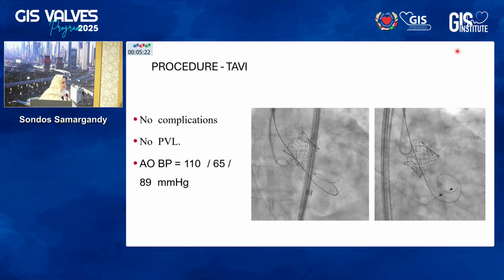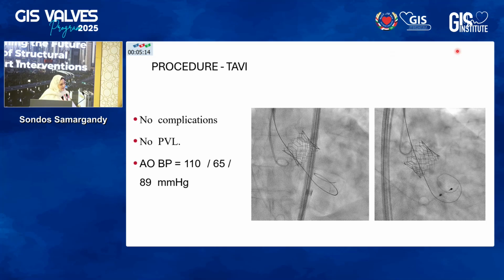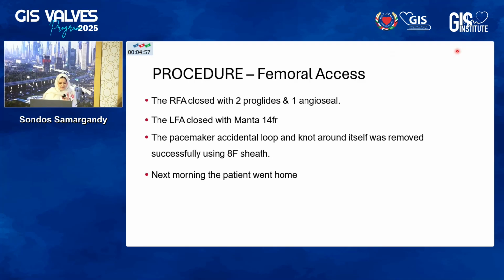Well, based on what was also explained before, there was a lot of calcification to the right side, and this is exactly what happened there. You have predicted that this is the under-expansion of the valve in this way. I would believe that we should not push it more in this direction, and that we should accept this result. Okay, so less is more. The enemy of good is better.